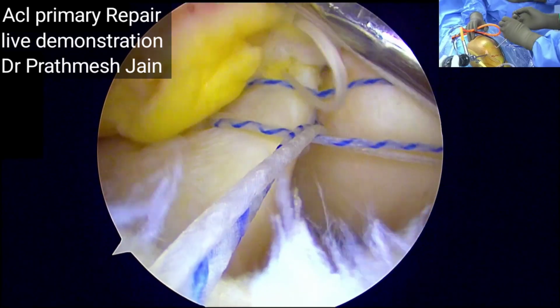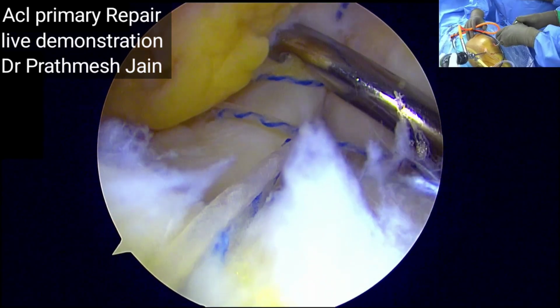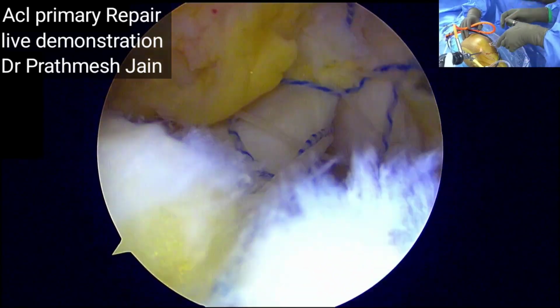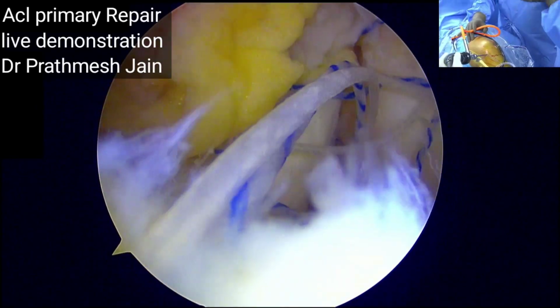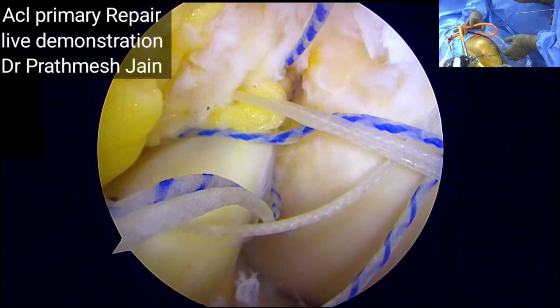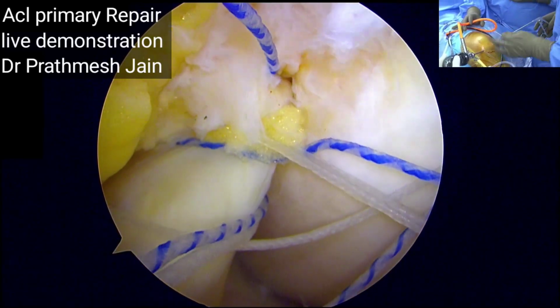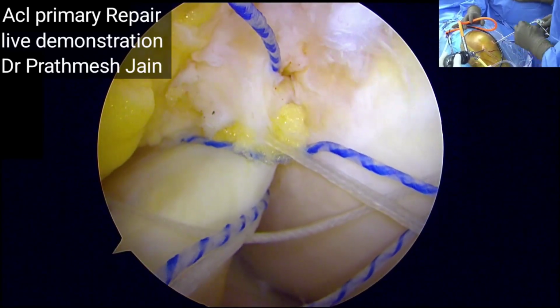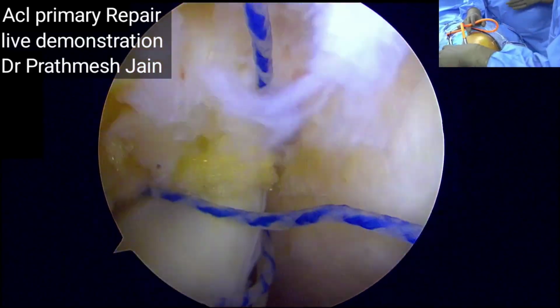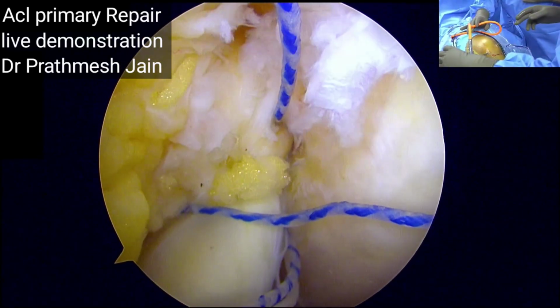So this is the first suture, and this will give us the desired reduction of the flipped part of the femoral avulsion, and then we are free to do the other parts of our repair properly. So this is my first suture limb, which is cut.